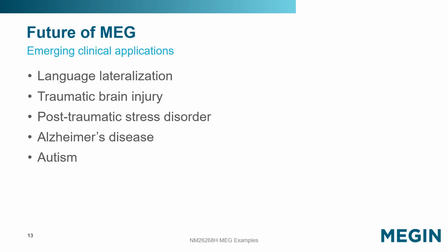An extensive search for new ways to use MEG in clinics is underway. Most promising approaches include detection of plastic changes elicited by different types of brain or peripheral nervous system pathology. Modification of spontaneous MEG signals detected by various signal analysis methods in patients with stroke, head trauma, or degenerative brain diseases may also provide clinically useful information in the future.